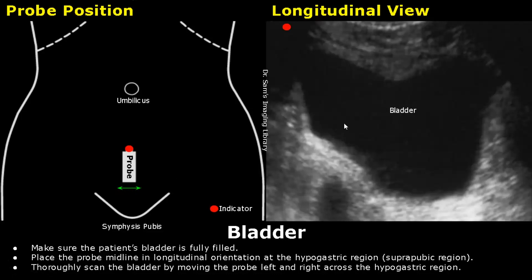To scan the bladder, make sure the patient's bladder is fully filled. Start by placing the probe midline in longitudinal orientation at the hypogastric region, which is also called the suprapubic region, and you will get this image — we can see a fully filled bladder.